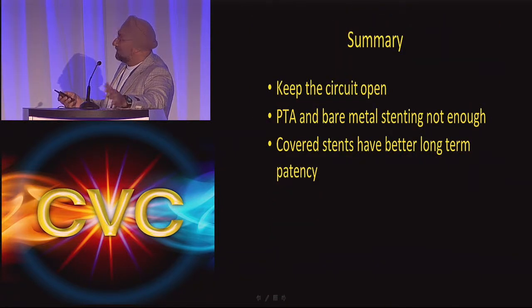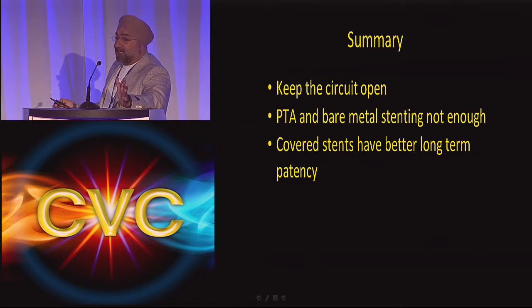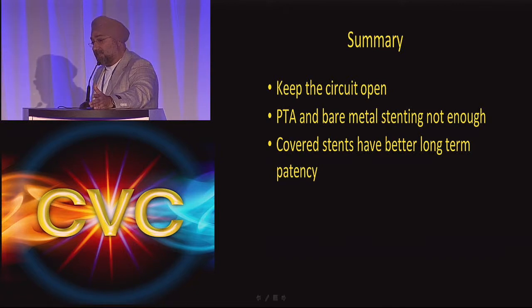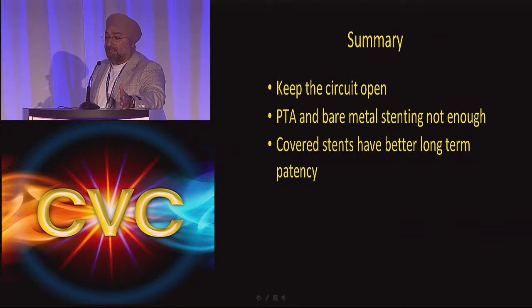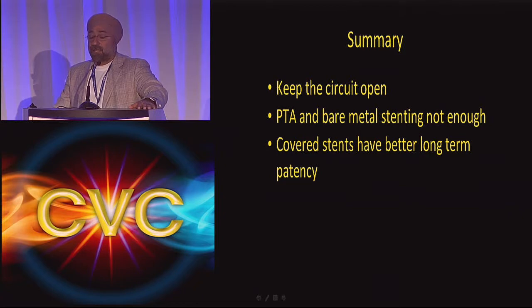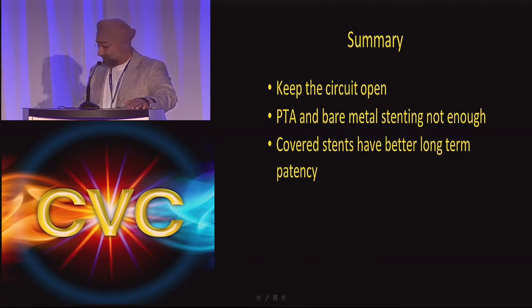All right, so in summary, dialysis access is all about keeping the circuit open. You want to find ways where you can keep it open a long time. Angioplasty alone doesn't work well enough. Bare metal stents, same as angioplasty. Covered endografts, much better options. I'm sure there'll be better things coming down the pike into how to keep these open as long as the patient's alive without having to intervene again and again. Thank you very much.